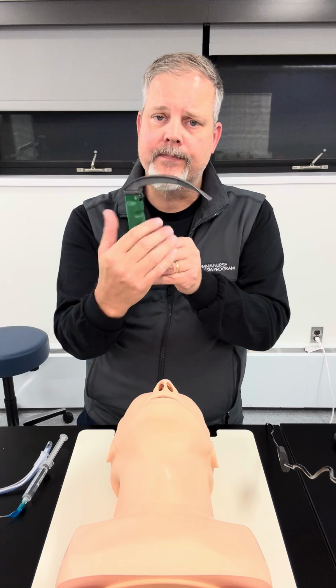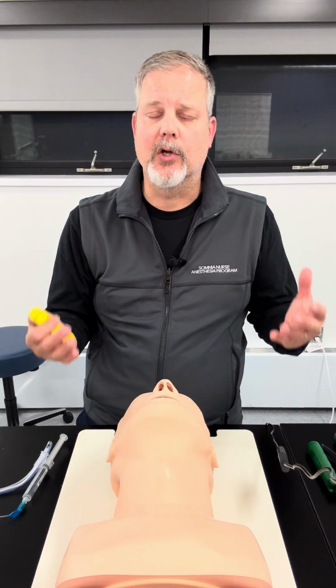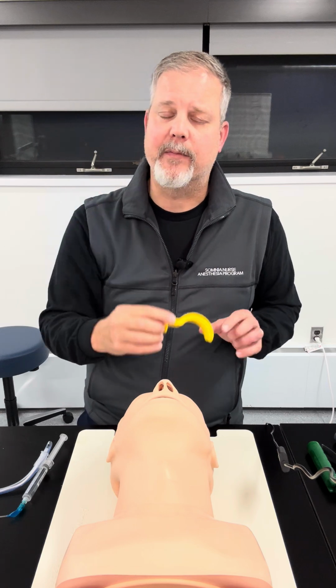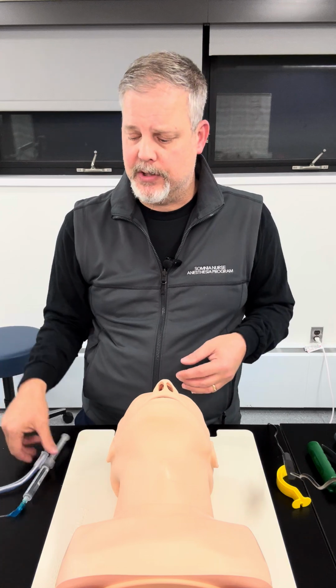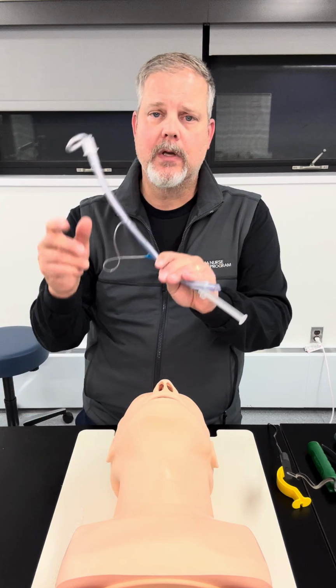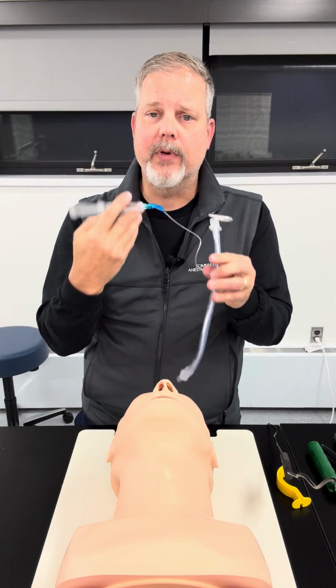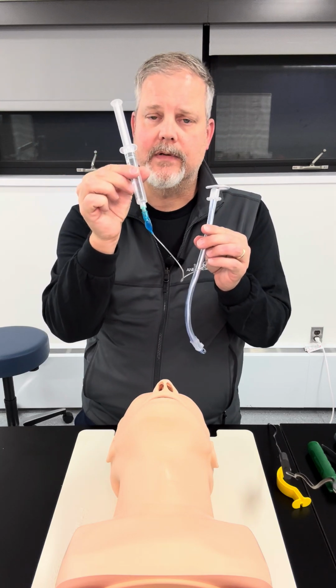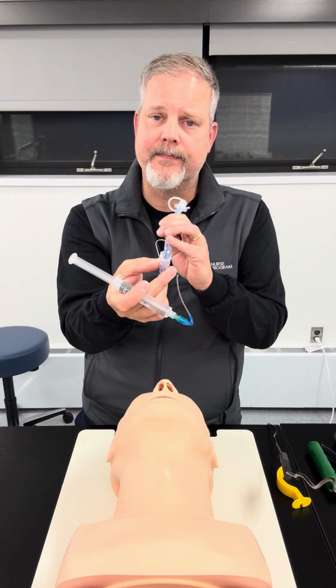This will be used in a little bit of a different fashion than the Miller blade. The other things that we need to have: in case we're having a little bit of trouble getting the airway in and we have to continuously bag mask ventilate this patient, we want to make sure we've got an oral airway of an appropriate size. And then, obviously, we're going to be placing an endotracheal tube, so we'll need an endotracheal tube. We'll need a stylet that we can put down into the endotracheal tube. And then we'll need a syringe on the pilot balloon to inflate the cuff after we insert the tube.